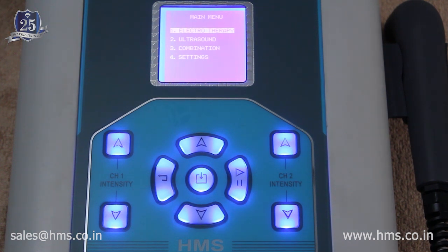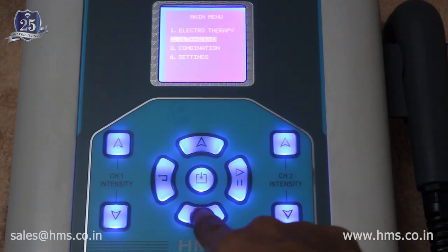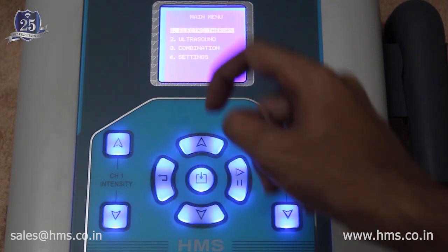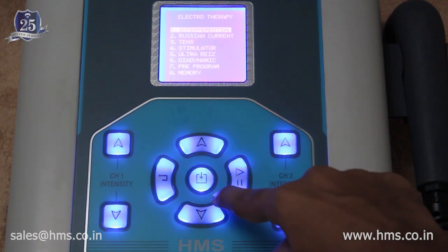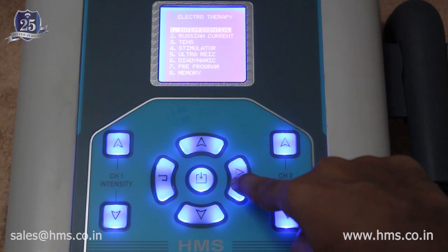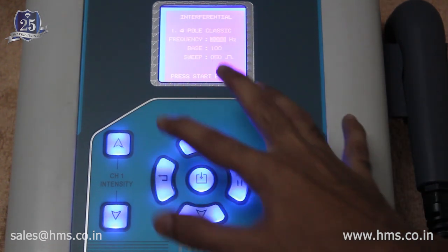Let's start with the key functionalities. The two keys at the top are used to navigate through the main menu — pressing the down arrow moves the menu down and the up arrow moves it upward. The middle button selects the highlighted menu item, and the button to the left goes back. The start-stop button starts the treatment after you have selected your modes.